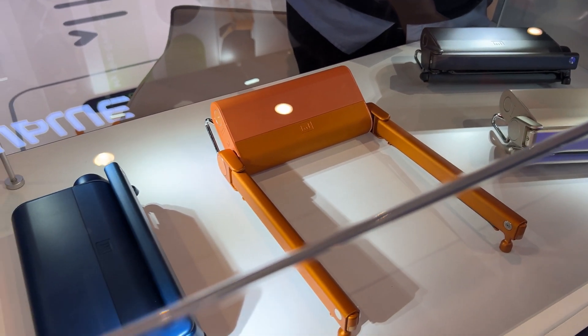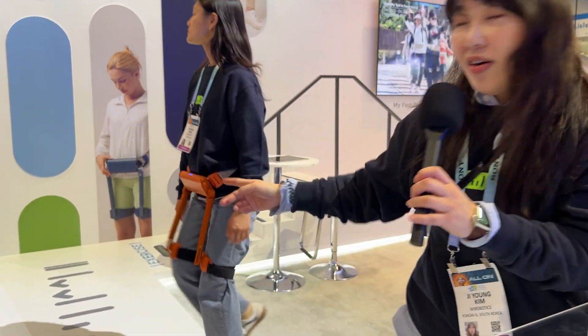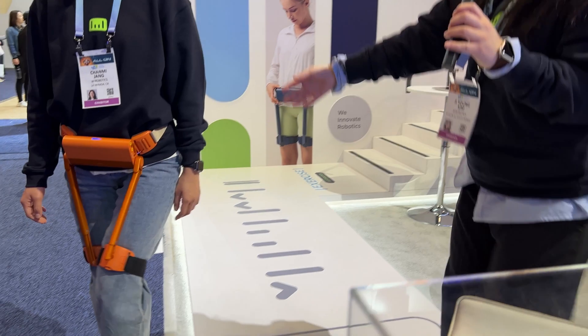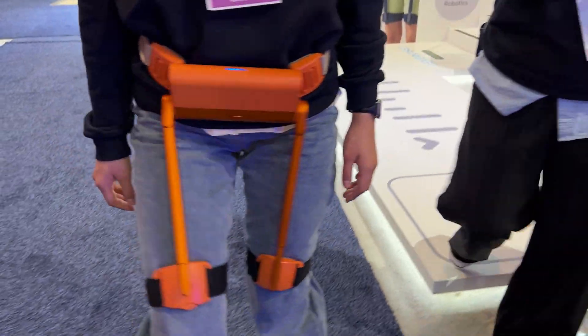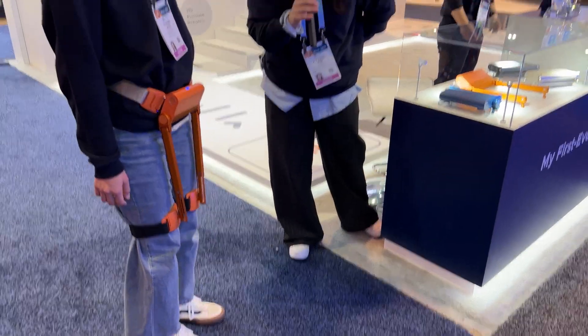If you mix assist and exercise, it can be great interval training. You can see her — now she is working with assist mode.